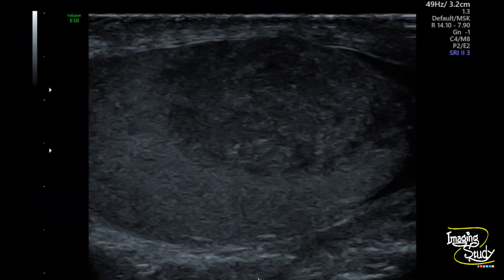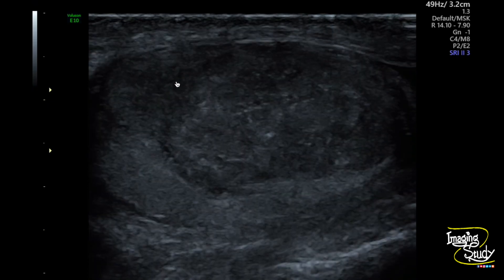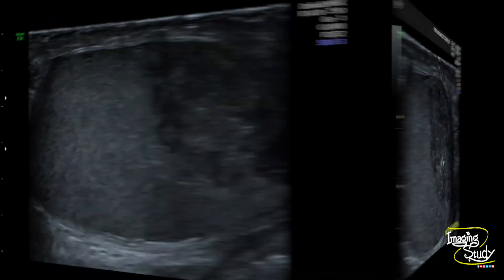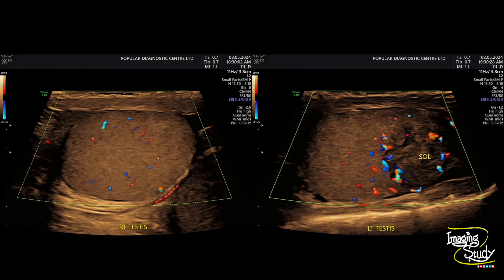Here you can see this irregular mass with internal microcalcifications. Here's another picture showing the irregular mass with microcalcifications at the antero-inferior part of the left testis. Now we have applied color Doppler, which is very important for our assessment.